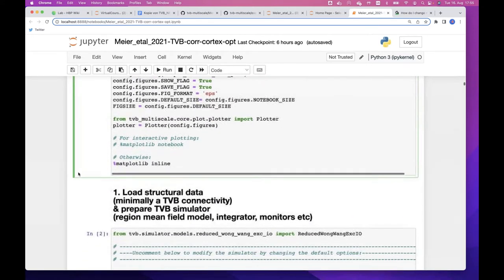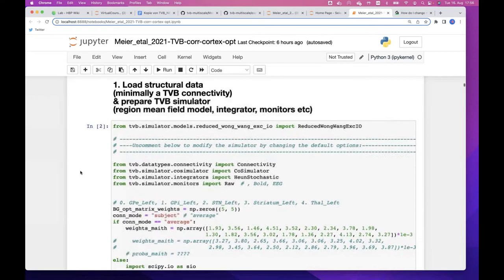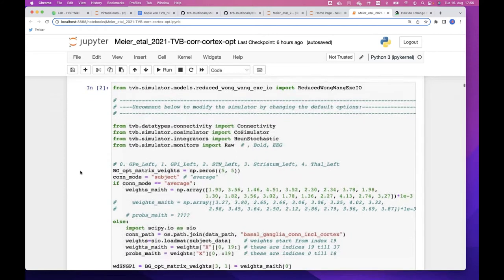You see the frequency, for example, that clinics often use is 130 hertz, and we have here 130, and we will now use the monophasic stimulus that has 120. So quite close to realistic clinical settings, and a duration of 0.3 milliseconds. So quite short. So then it tells you about the output path, and if you set the flags to true, you will have lots of figures actually.